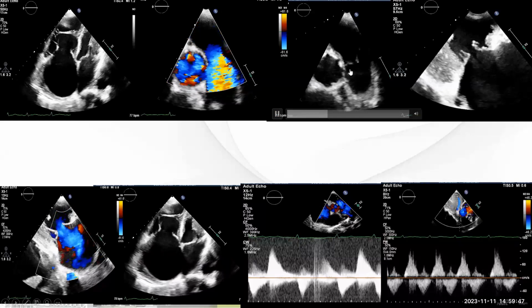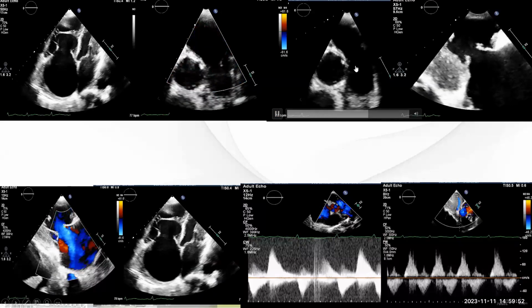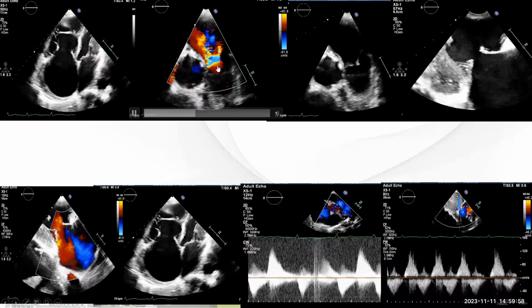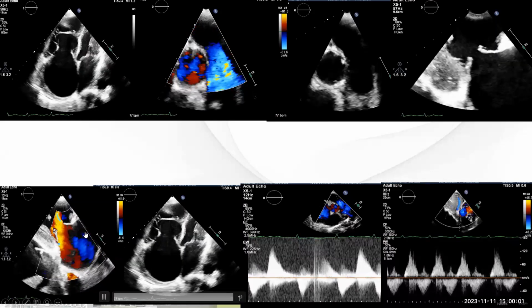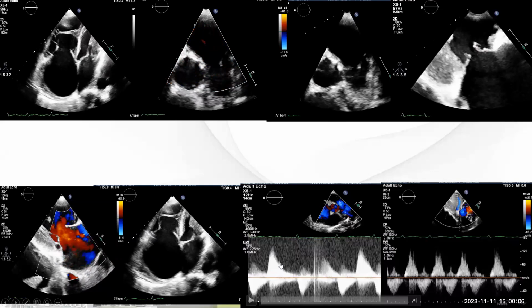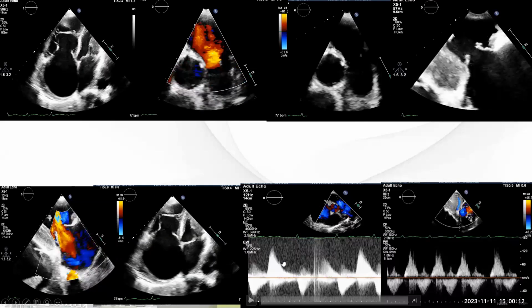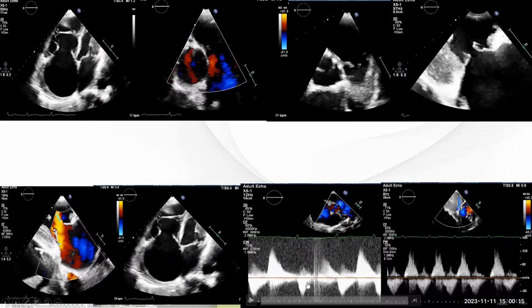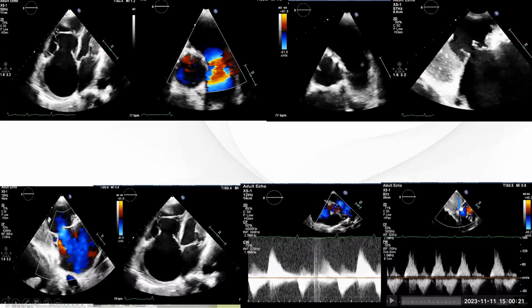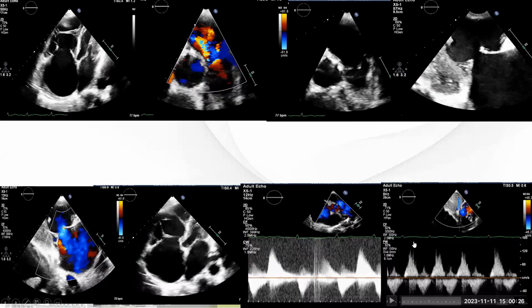Again, here I have calcified pulmonic valve leaflets. You can see calcified, some restricted opening is not normal, because pulmonic valve leaflets usually are very thin, and they have significant pulmonary valve regurgitation. Nice. So once I have all of these, the CW across the pulmonary valve indicates severe pulmonary regurgitation here: dense jet, triangular, and very short pressure half time or steep descent, and they have some pulmonary valve stenosis. And here in the hepatic vein pulse wave, I have systolic flow reversal. That means this is an indication of severe tricuspid regurgitation.